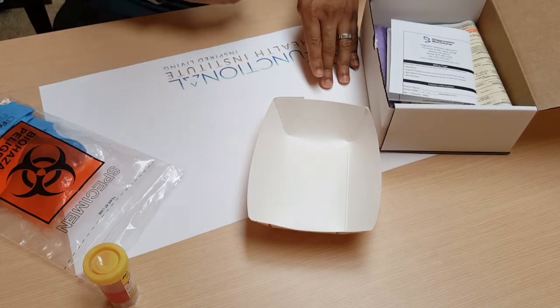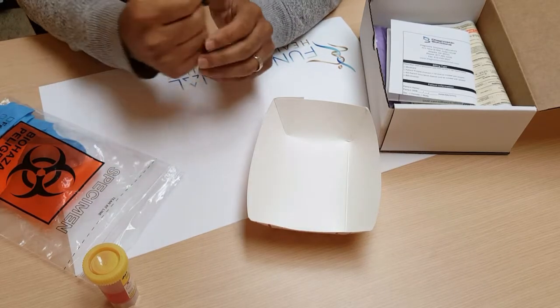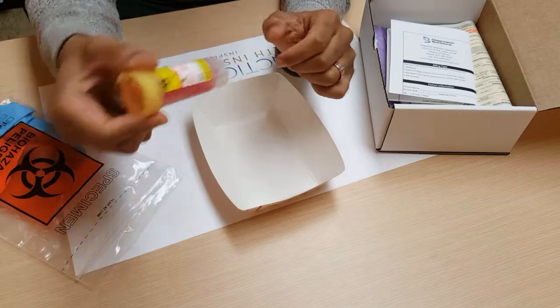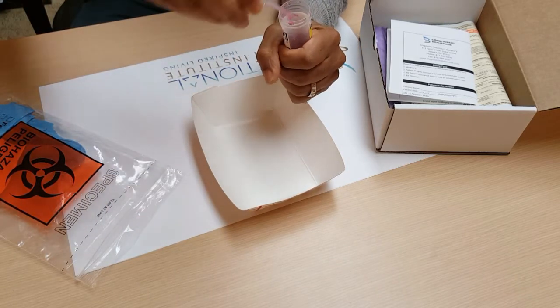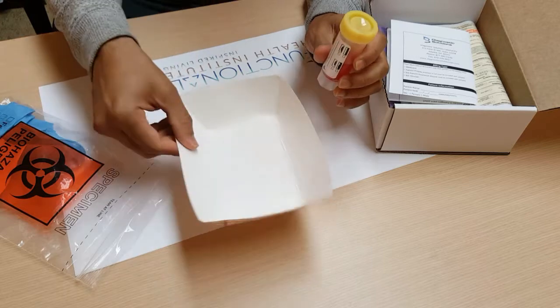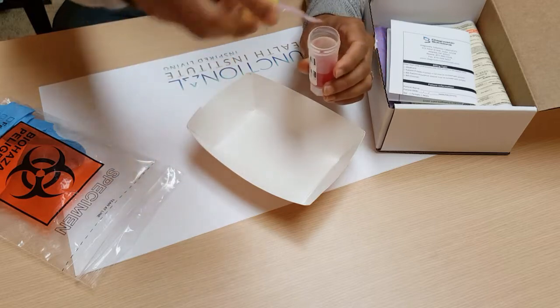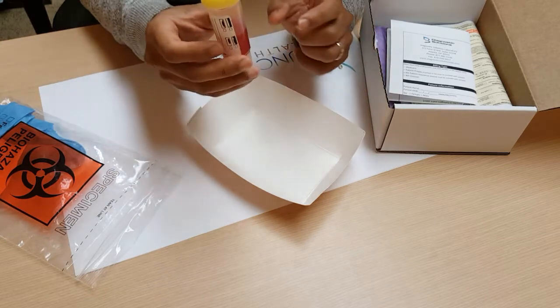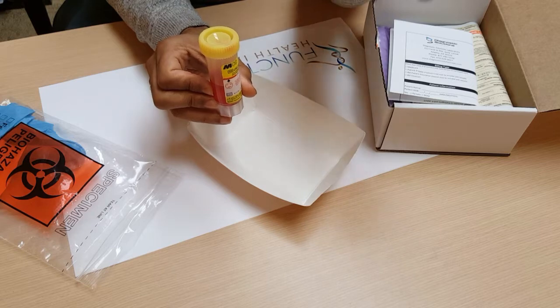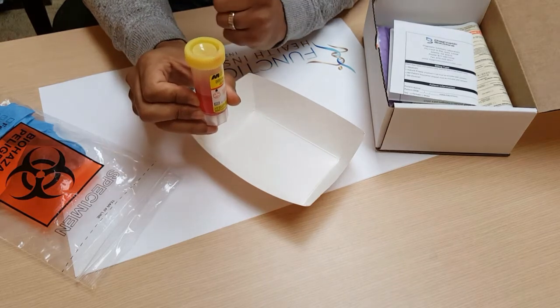On the day you're collecting the stool, try to avoid getting any urine in the sample, and use the paper tray to collect your stool. Inside the yellow vial, when you open it up, there is a spoon attached to the lid. Once the stool is on the tray, take the spoon and from two or three different places, collect the stool and put it into the vial. You only want the red solution to fill up to the red line. If you put too much, it changes the lab results and they can't use it as a sample, and you'll have to redo the whole process.